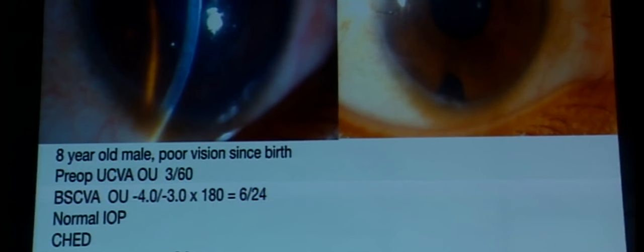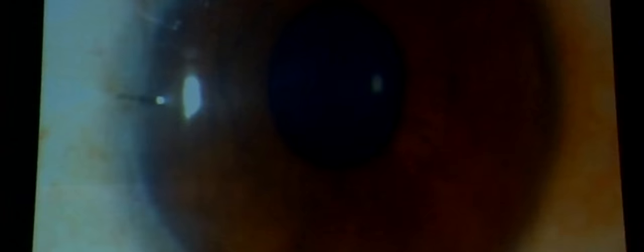I will share two of my recent cases — brothers and sisters. The brother had diffuse bilateral corneal edema. Pre-op uncorrected vision was 3/60, and with best spectacle correction of -4 with -3 cylinder, vision improved to 6/24. IOP was normal. We decided to proceed with DMEK. The 8 mm mark was made — the corneal diameter is slightly reduced, almost reaching the limbus. The edematous epithelium was removed to improve visualization.